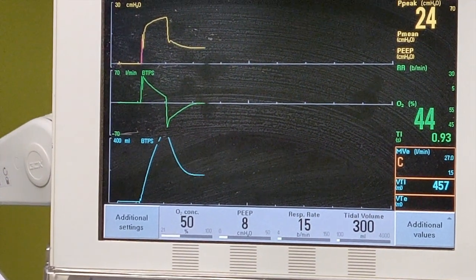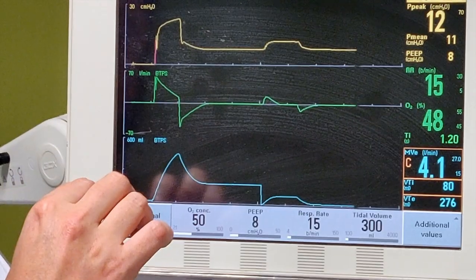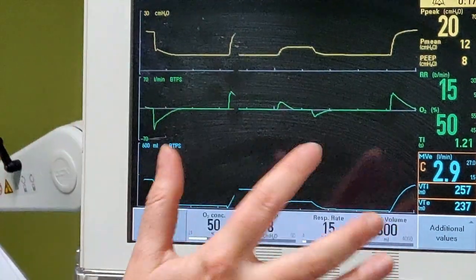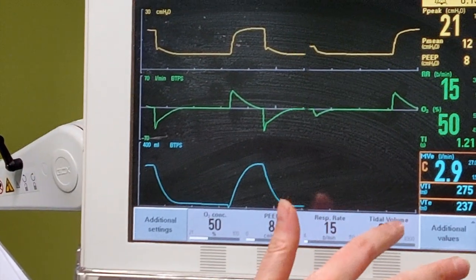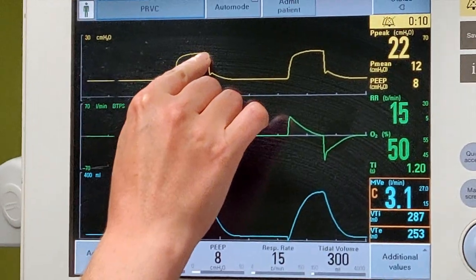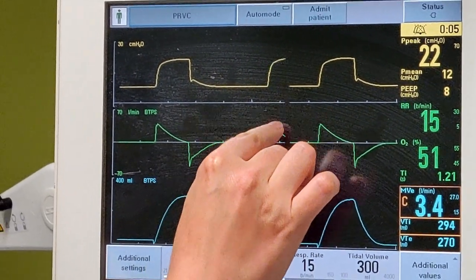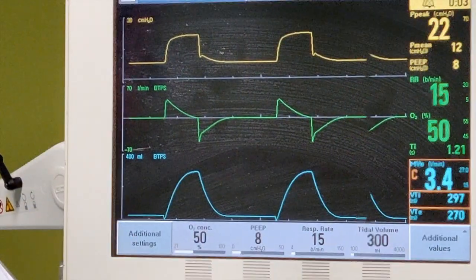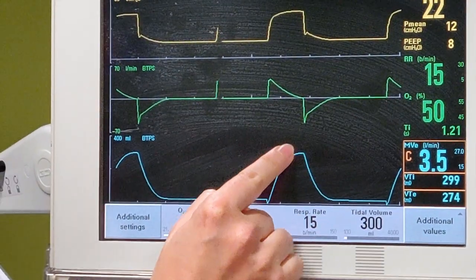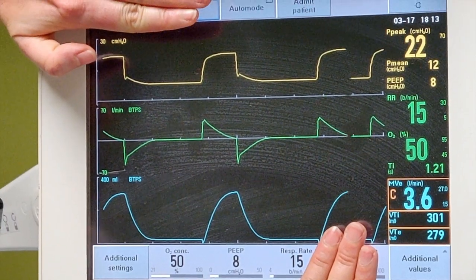And when we start, we're going to see pretty quickly when the ventilator finds the pressure where it's happy that you're getting the 300 mL of tidal volume that we set up, that we have a square pressure time curve, same as pressure control. We have a decelerating flow time curve, same as pressure control, and we don't have a flat top on volume. This is a pressure control modality. If I hadn't shown you this, you would say this is pressure.